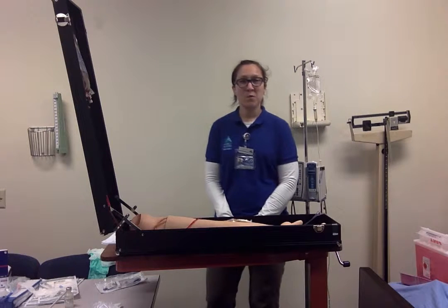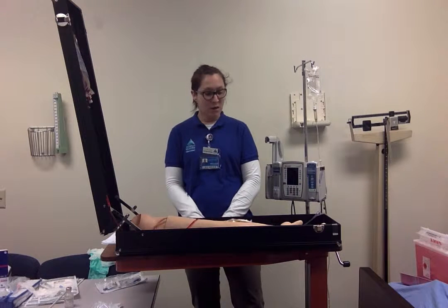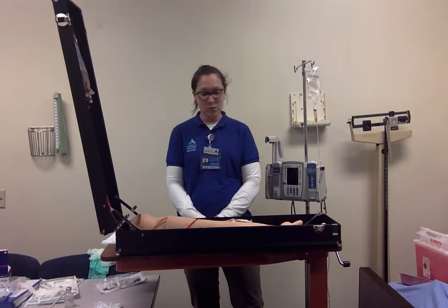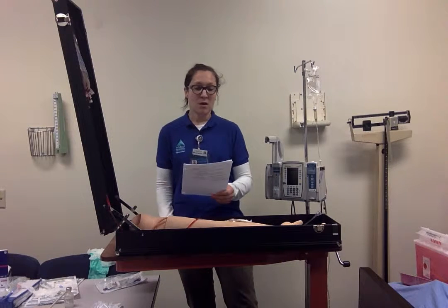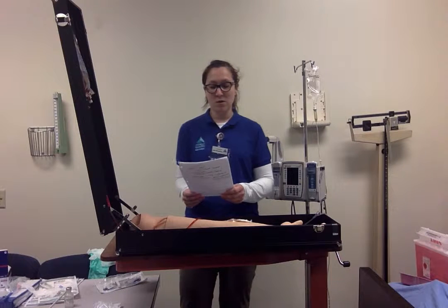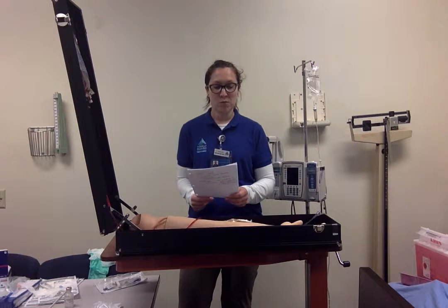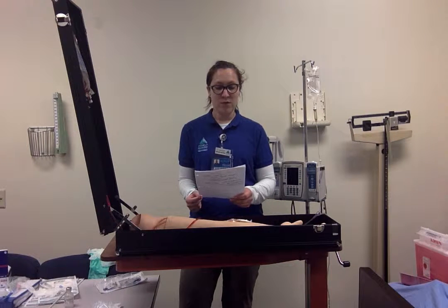Hello, I'm Megan. I'm going to be demonstrating a piggyback IV. First thing that I want to do for standard protocol is check the physician's orders, which I have right here in my hand, making sure the patient has no allergies. He has ordered Rocephin 1 gram, which we're going to be administering via IV over 30 minutes.